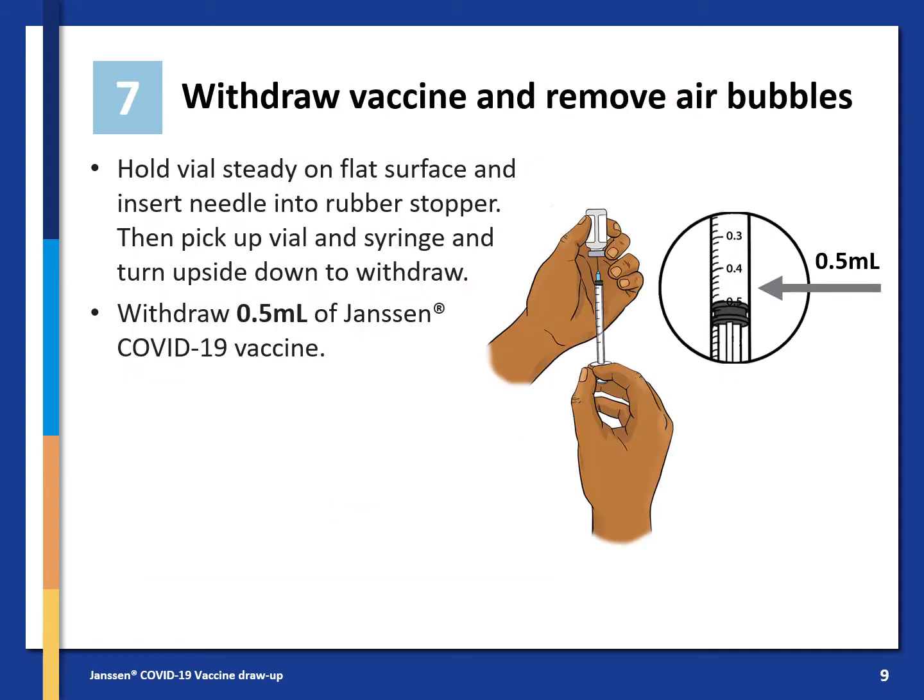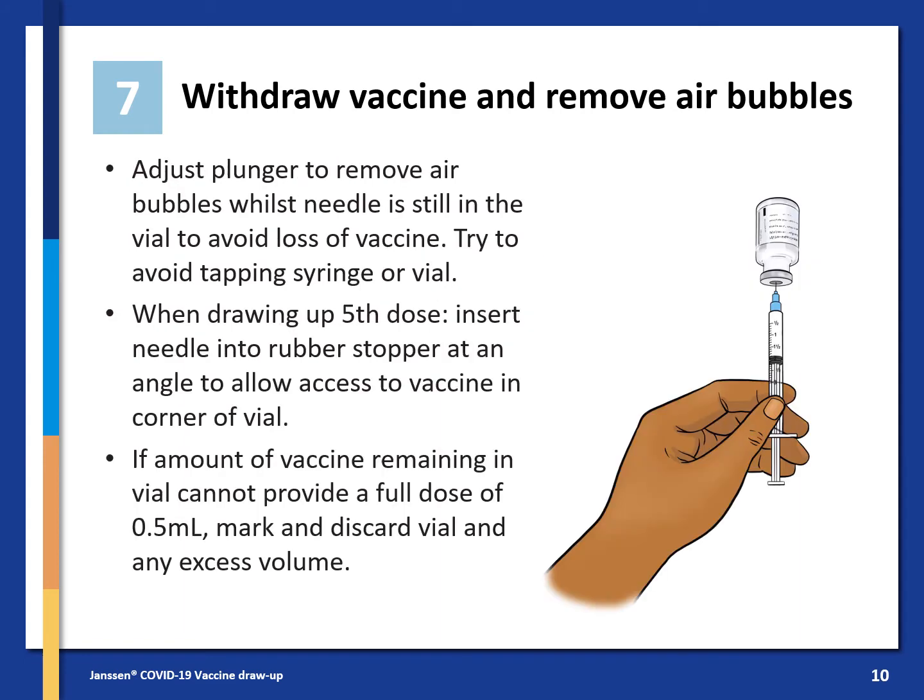Now you are ready to withdraw the vaccine and remove any air bubbles. Hold the vial steady on a flat surface and insert the needle into the rubber stopper. Then pick up the vial and syringe and turn them upside down to withdraw 0.5 ml of the Janssen COVID-19 vaccine. Adjust the plunger to remove air bubbles whilst the needle is still in the vial to avoid loss of vaccine. Try to avoid tapping the syringe or vial. When drawing up the fifth dose, insert the needle into the rubber stopper at an angle to allow access to vaccine in the corner of the vial.